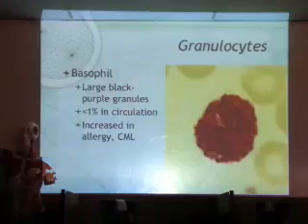The granules are not always uniform in size; they're kind of random size. Sometimes they even look like a little irregular thing, like broken up charcoal. In this example, the granules cover almost the entire cell, so you can hardly see the nucleus. But some basophils may have just a few granules, so you can actually see the nuclei.